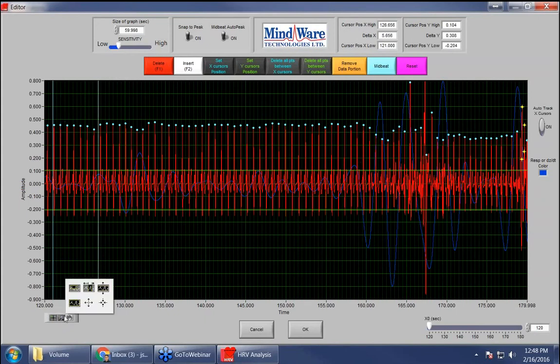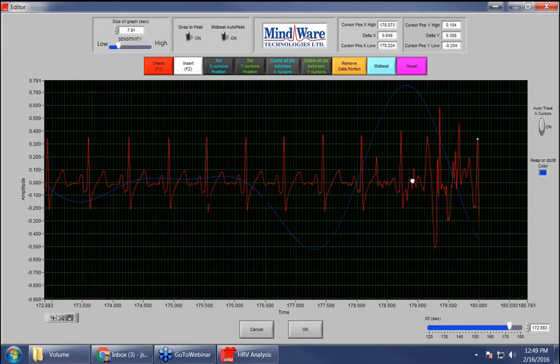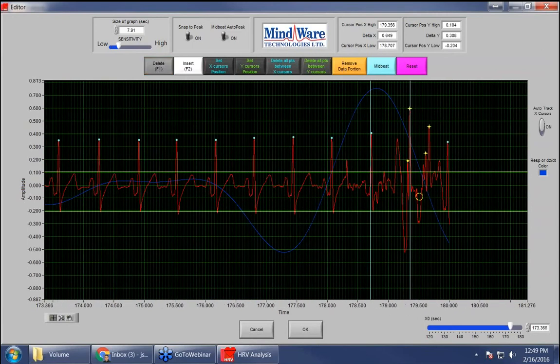Give myself a little bit more room. Okay, perfect. And I'm gonna get my timing again, just try to figure out some of these. Okay, and I'm coming over here, and then we can basically see here that this one again is lined up, so then I can simply come over here and delete this.